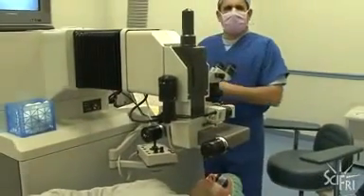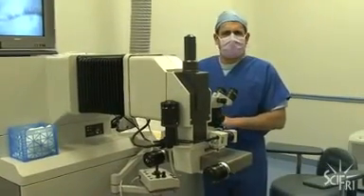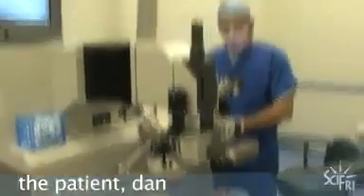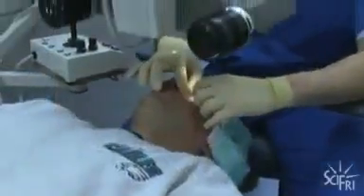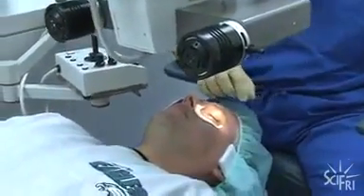But before we can go zapping corneas, Dr. Vail has to prepare the patient. Hi, it's Dr. Vail again. We're here in the operating room with our patient Dan. Dan's already been pre-medicated, and he should be pretty relaxed, but if he's not, we'll deal with it. Patients are not put to sleep for LASIK surgery. We need them to fixate on the fixation light so that the laser can fire. And we do have a tracking system for the laser, but if the eyes couldn't look up at the laser, there's only so far the laser would track.